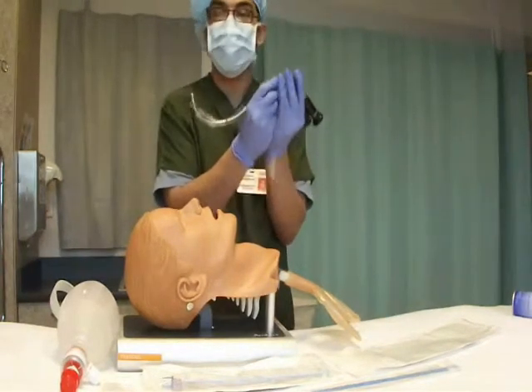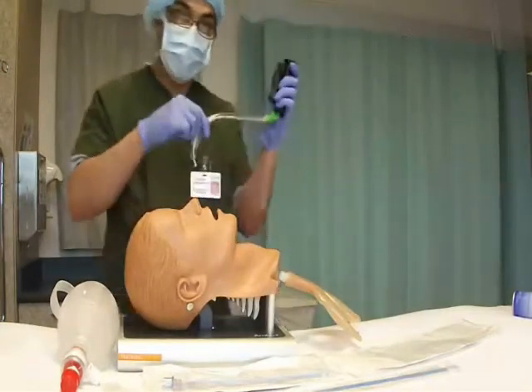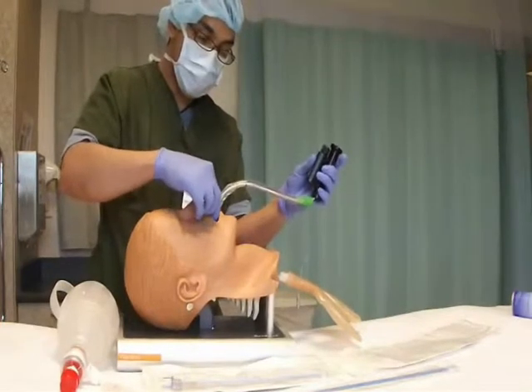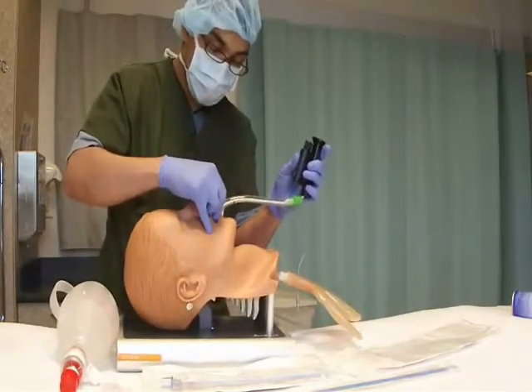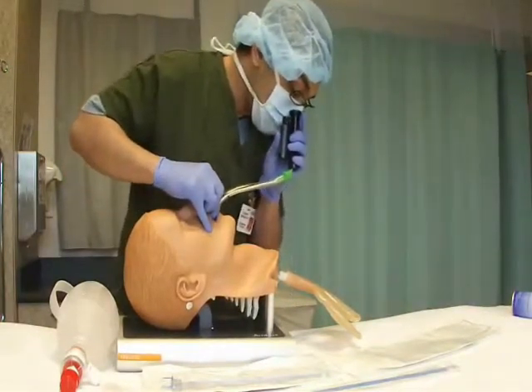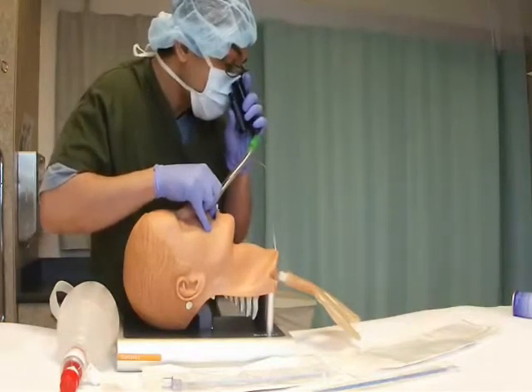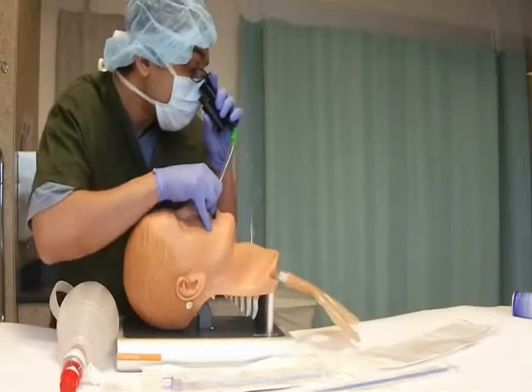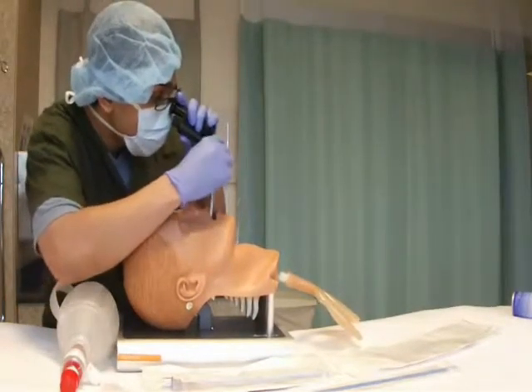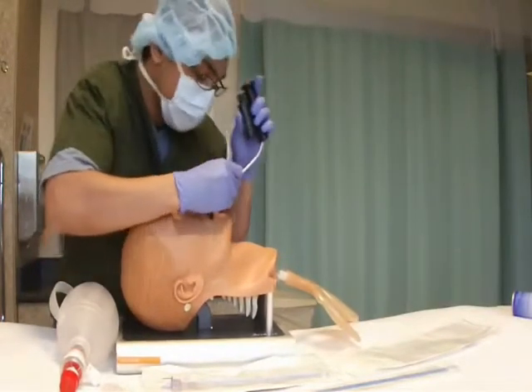For RFS-assisted endotracheal intubation, an ET tube is placed over the shaft of the stylet. With the patient in neutral position and with limited mouth opening, I see the tip of the stylet going through the patient's teeth until I can see the uvula. As I straighten out the stylet, I see in sequence the patient's epiglottis. I go under the epiglottis, see the trachea, and enter the trachea.